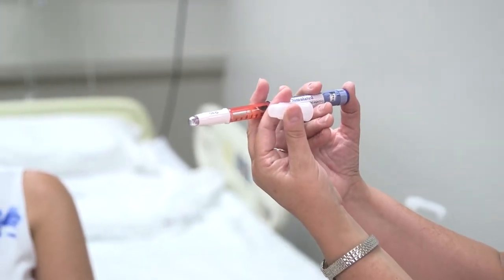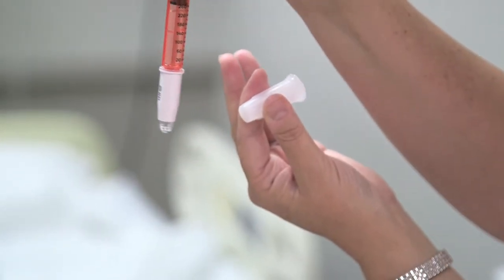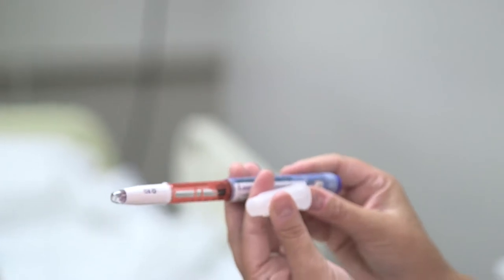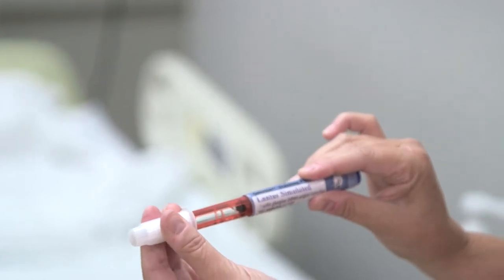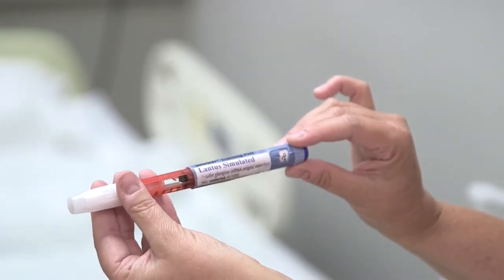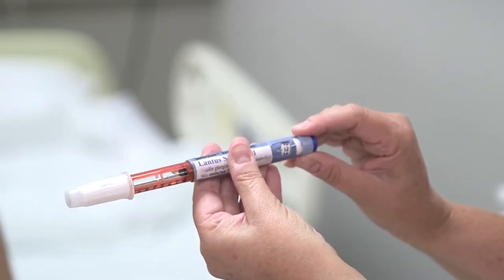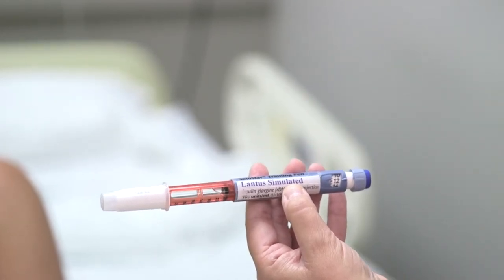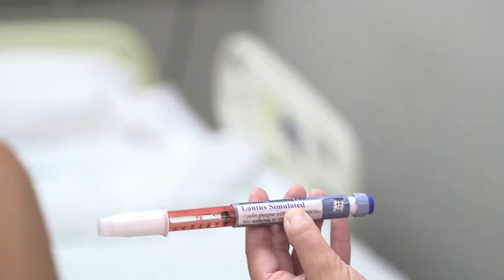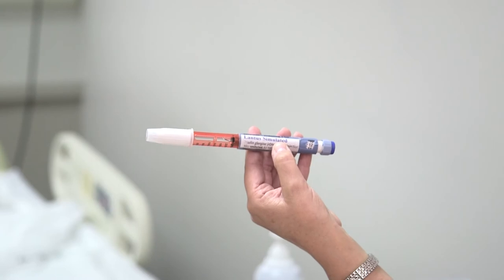You would normally see a little drop of insulin come out during priming. Once you know it's functioning, set your dose. Our patient is going to get 12 units of Lantis, so we dial it to 12. Now we have our dose set at 12 units and can proceed to do our medication checks before administration.